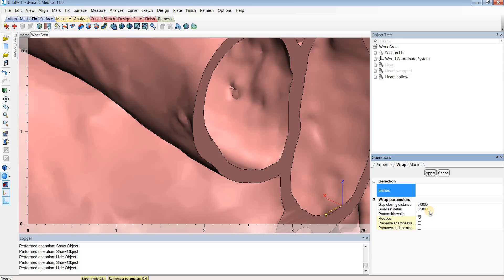One option to fix this would be to go back and edit our segmentation, or redo the WRAP operation with a smaller detail level. But this can take a long time, especially if you've already done other modifications like smoothing, cutting, or labeling, as you'd have to redo all of those edits as well. So to avoid this, we can do just a couple easy steps to get rid of these holes.